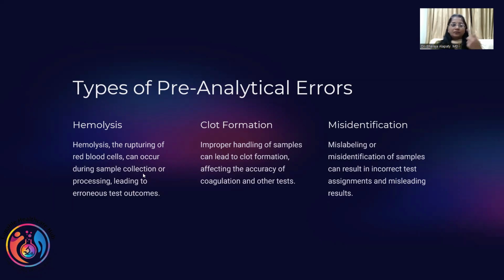Red blood cells, hemolysis, clot, microclots. The WBC is gone inside, the RBC is gone inside, the platelets are inside the microclot. Then what values will you get? 100% it will be wrong. And that is when you have to look into the histogram in the system. So just one small mistake. You have a sample, they have not mixed it properly immediately. Microclot formation. If they've not mixed, it means a big clot, that you can make out. But what you can't make out is this small one. That also we can make out by the histogram.